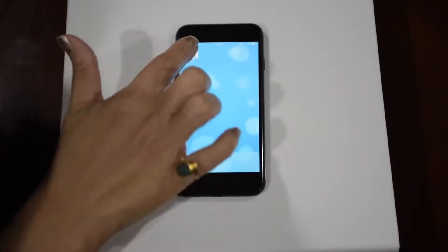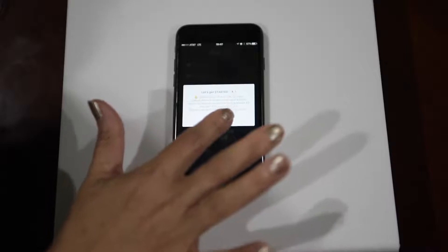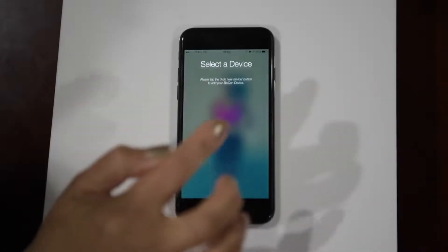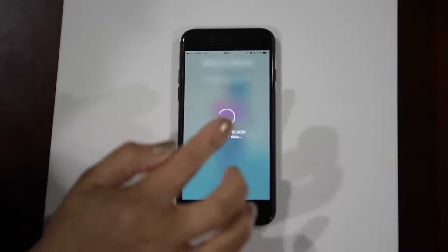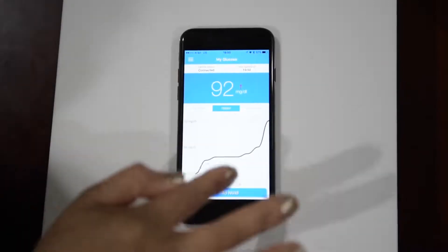Now launch the Bluecon app by tapping on the app icon. If you want to share the reading with your doctor or caregivers you can register, otherwise you can just skip the registration part and it will start receiving the readings from the sensor.